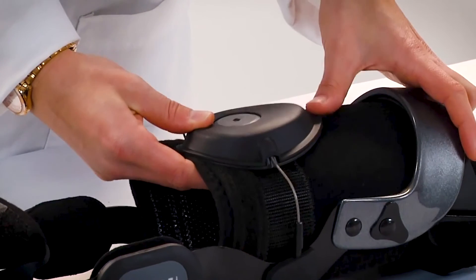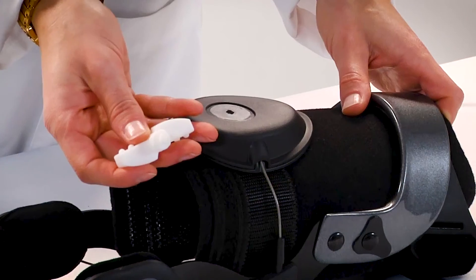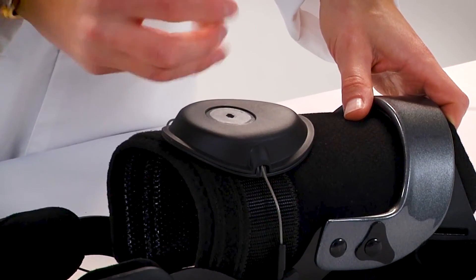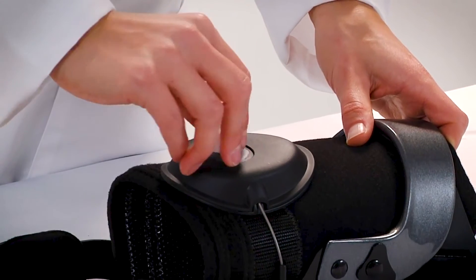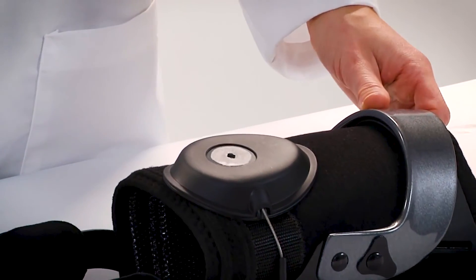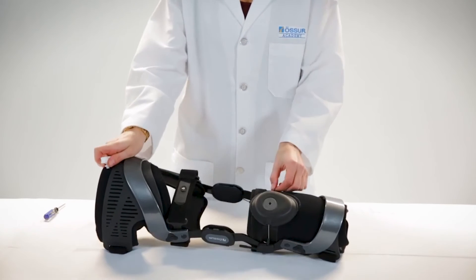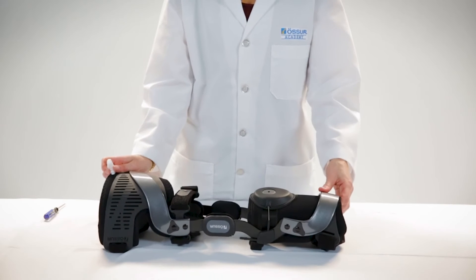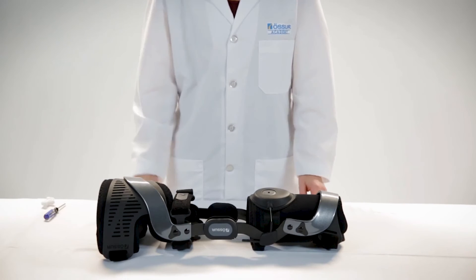Ensure that the cable is of equal length on each side of the DTS. Place the desired shear knob into the diamond-shaped hole on the spool and slowly turn it clockwise approximately half turn to lock the DTS onto the cable. The cable should be loose but of equal length on each side of the DTS. Repeat the device application instructions to fit the device and re-tension the DTS.